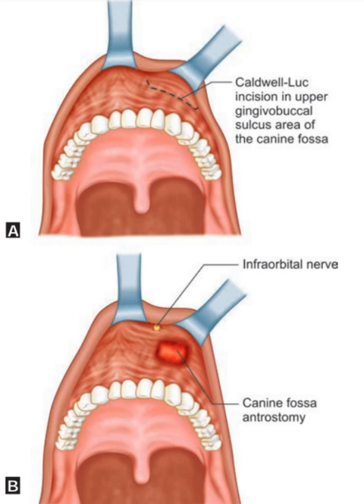Packing. Ribbon gauze packing, which is impregnated with liquid paraffin or furacin 0.2% with nitrofurazone ointment, is prepared. One end of the packing is brought out from the nasoantral window into the nose and the rest is packed in maxillary antrum. Packing is also done in the nose. Dressing. Forceps Tilley's, Wilde's or Hartmann's can be used for packing. The packing takes care of bleeding.